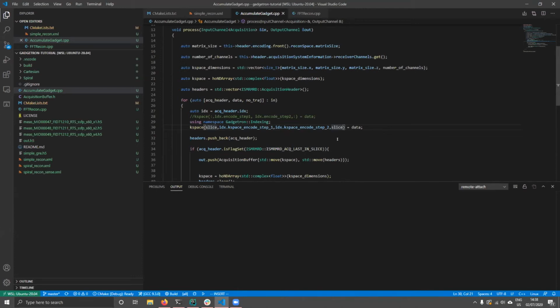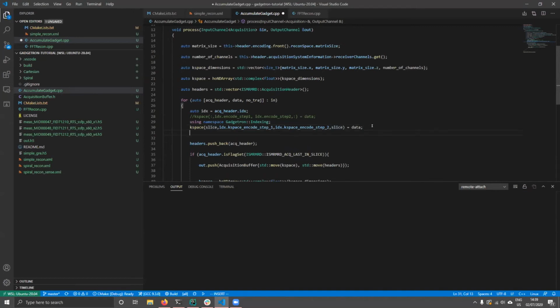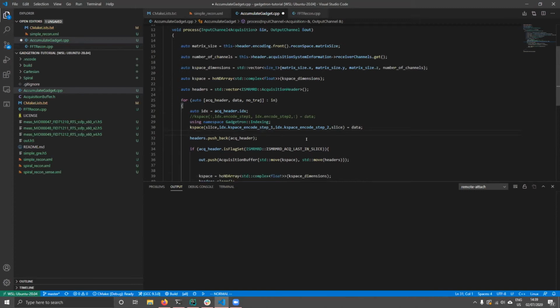And does slicing work in any dimension or just the first and last? It works in any dimension you want. So it's completely like the colon in MATLAB or in Python. So we could have like this. Like that's not going to work because the dimensions don't match. But besides that, that's the theory. Okay.